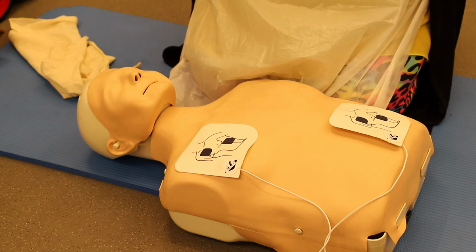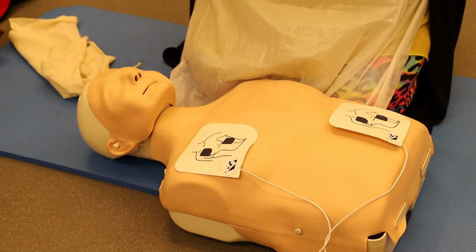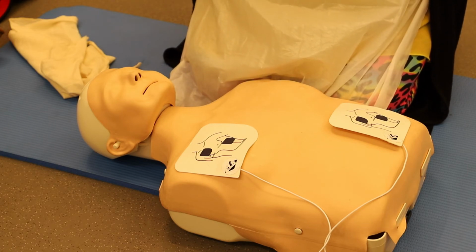It is important for you to remember how many times you press the shock button, because the ambulance people will need to know that. Okay, the machine will not shock the casualty automatically. You need to press the shock button to deliver the shock.